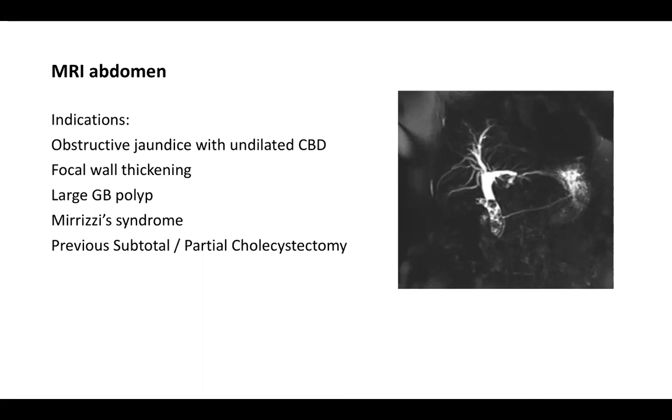The first question was whether you can make out accessory ducts. I think that is a good question, and MRCP is very good to pick up accessory ducts. The only caveat here is if you have a grossly distended gallbladder with the accessory duct coming just behind it, even if you rotate the picture, sometimes it may not be seen.